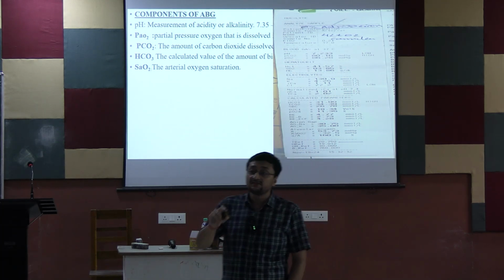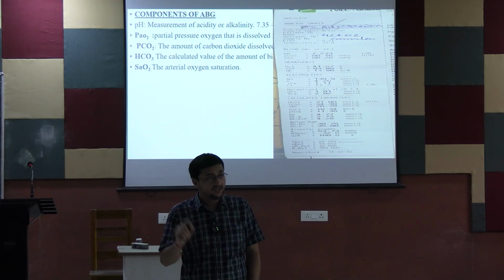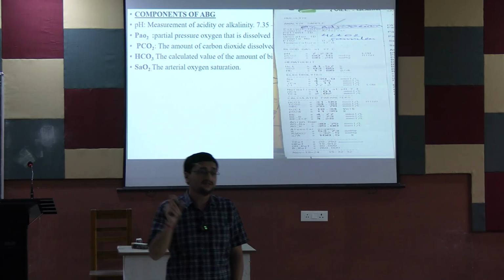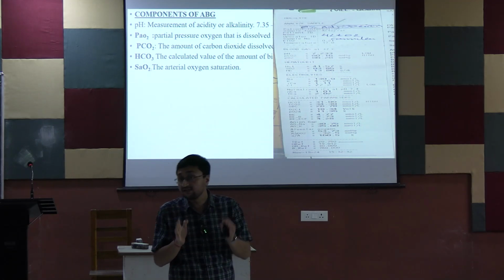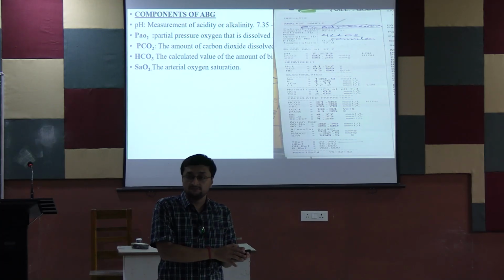So I have already mentioned PaO2, that means partial pressure of oxygen, and this is the saturation of arterial oxygen, SaO2.